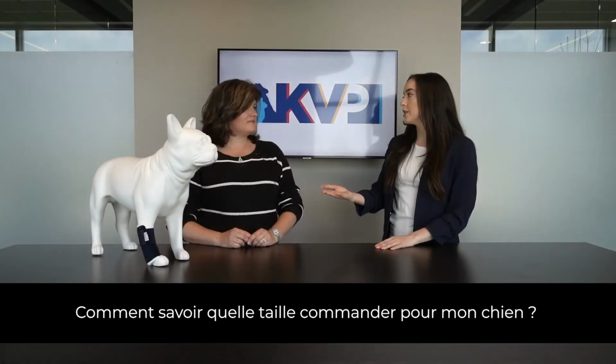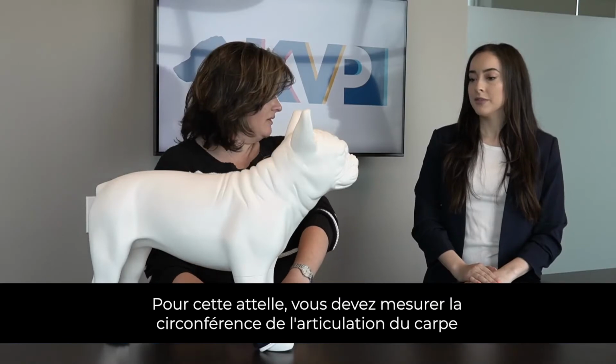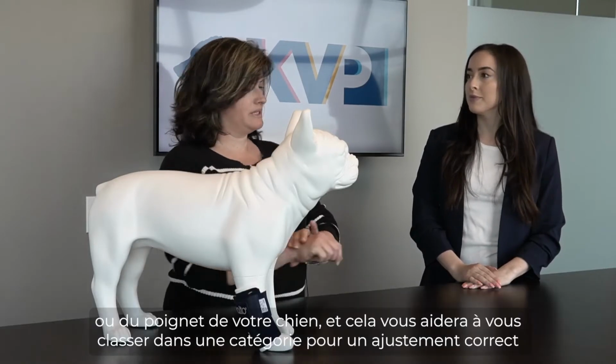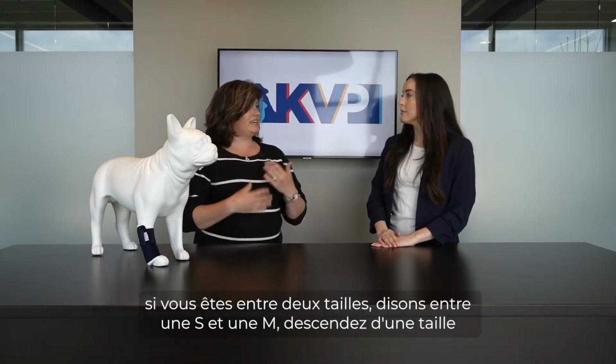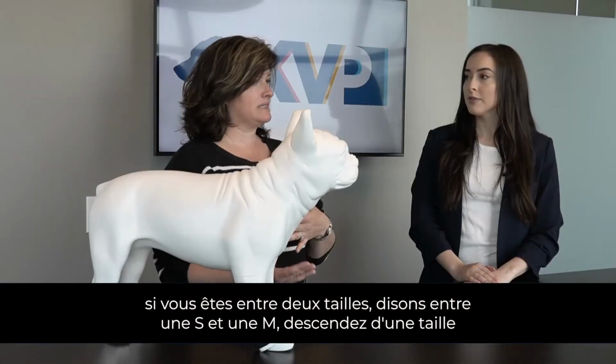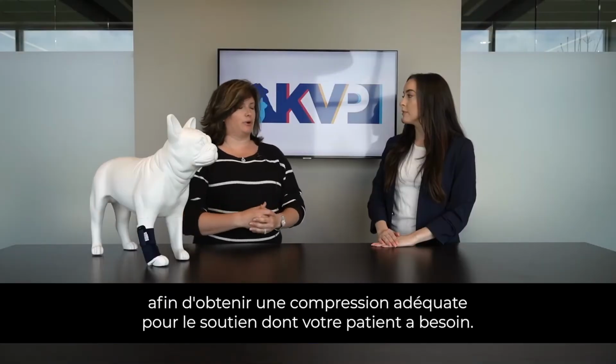So how do I know what size to order for my dog? So with this particular brace, you want to measure the circumference of the carpal joint, or the wrist, of your dog, and that's going to help drop you into a category for correct fitting. If you're between sizes, let's say between a small and a medium, go one size down so that we get proper compression for the support your patient needs.